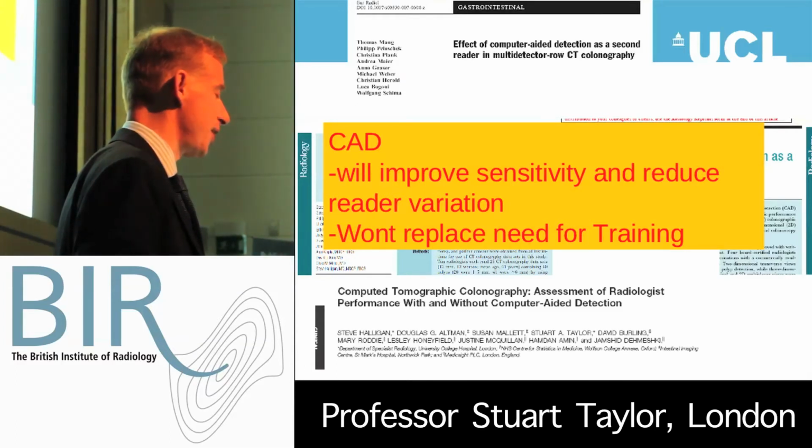Trouble is, it won't replace training. You can't just do CT colonography with CAD and expect to be at that 90% level, because CAD can point things out for you, but if you don't know what you're looking at, then clearly it's not going to help. So you do have to go through that training, unfortunately.